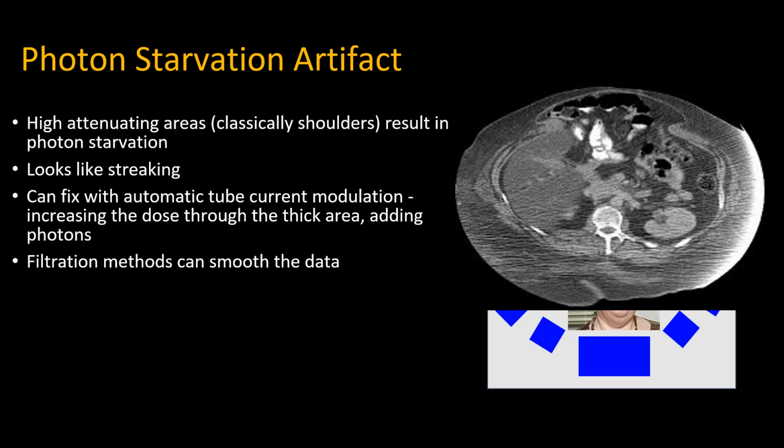Here's an example like we've all seen from patients that barely fit in the scanner. There just aren't enough photons to penetrate the patient's body habitus.